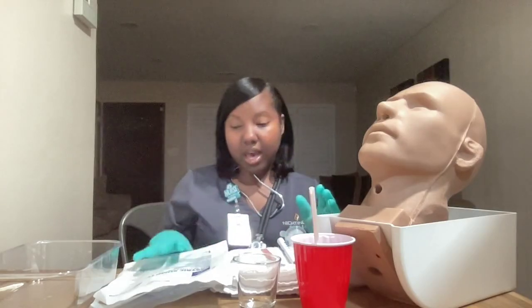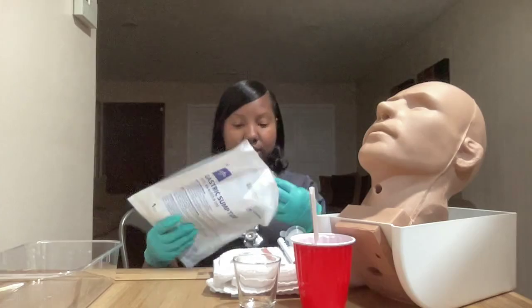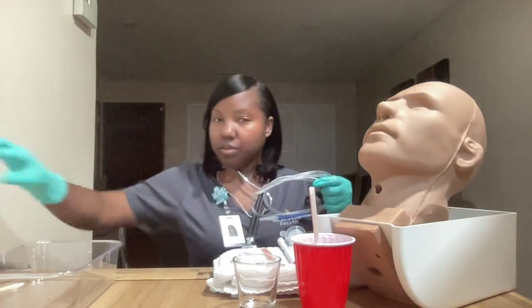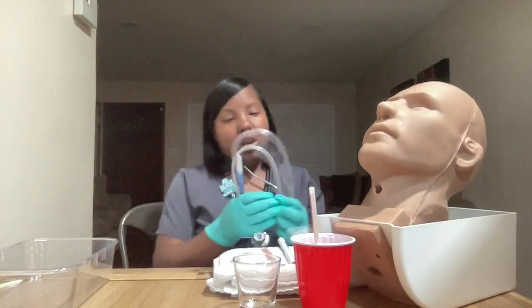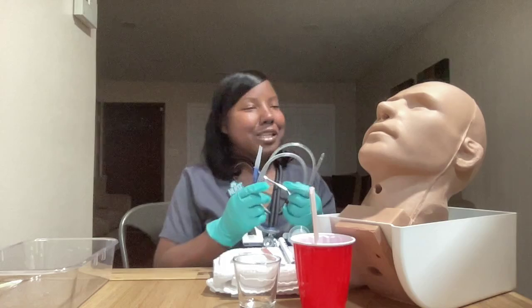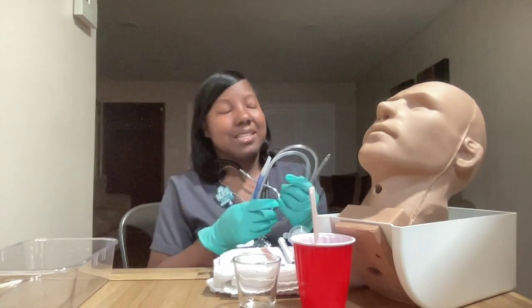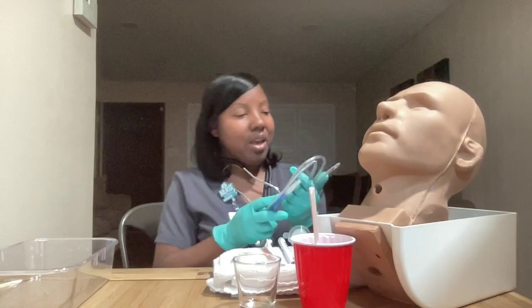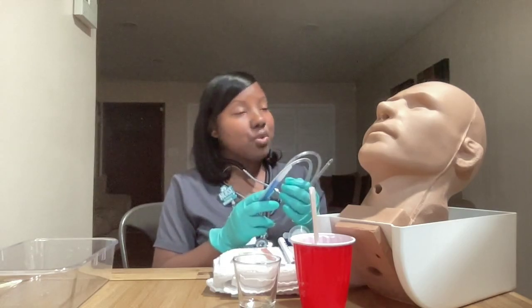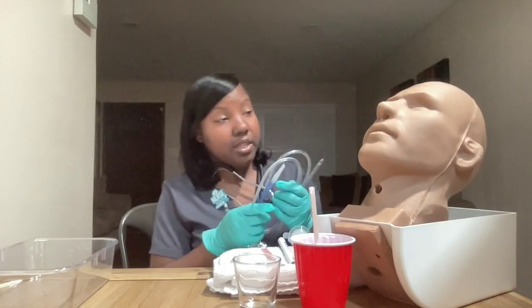I am going to begin by preparing my supplies. Ms. Jones, I know this is not a procedure anyone looks forward to, so I will try to make this as comfortable as possible. I will explain every step to you, and if you have any questions, do not hesitate to ask me. Do I have your permission to proceed?